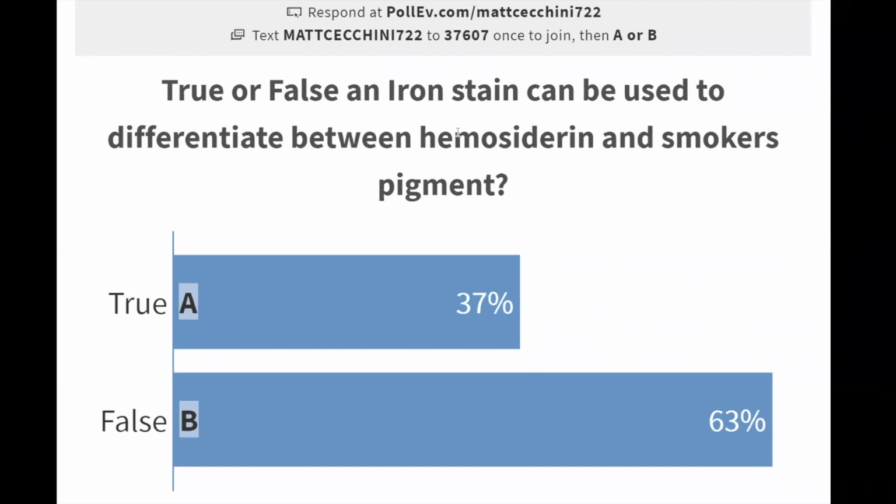And so just to recap, let's talk a bit about smoking-related lung disease because it could be kind of confusing. Respiratory bronchiolitis is really just the presence of pigmented alveolar macrophages that are associated with distal airways, and this is just the presence of essentially smokers. And then when you get to desquamative interstitial pneumonia, you really have diffuse amounts of these pigmented alveolar macrophages that can often have a much lighter staining for the pigment, and it expands and fills these alveolar spaces way out into the alveolar lung parenchyma.